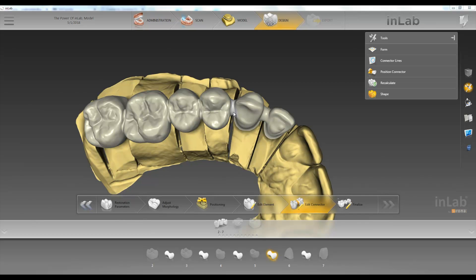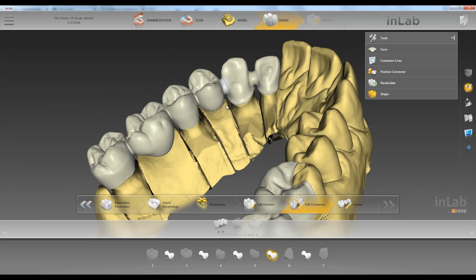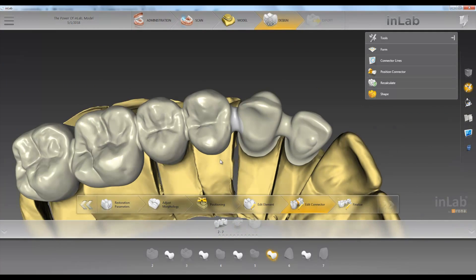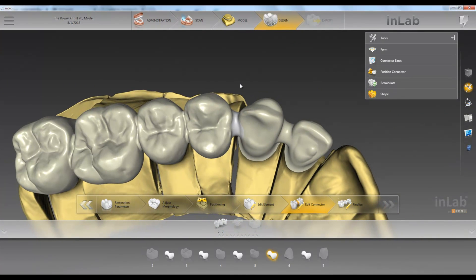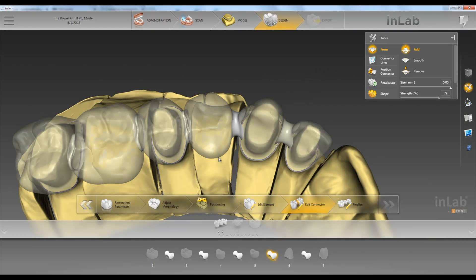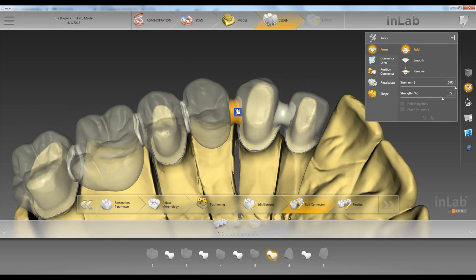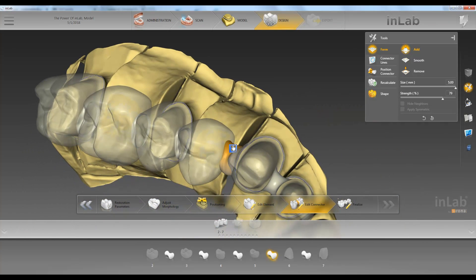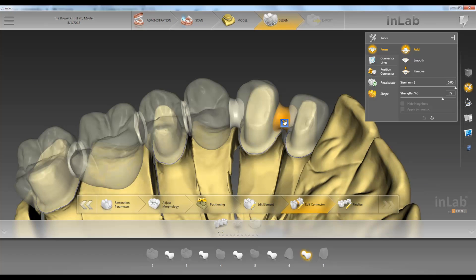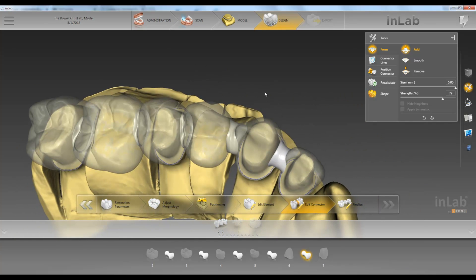Here we have an anatomical connector. If we pull up our connector tools, first we have the form, add, smooth, and remove. So let's say we want to add some material to our connector — just add like so.